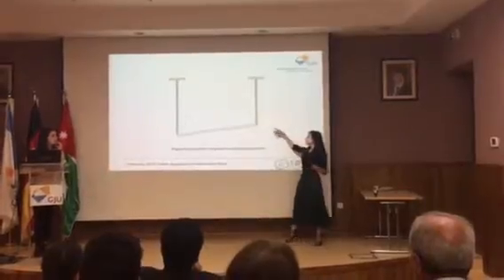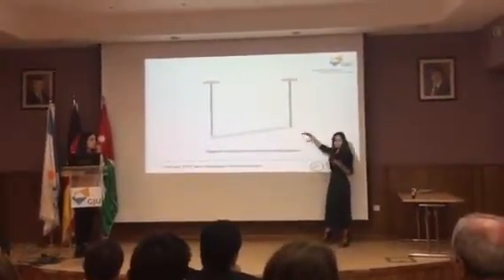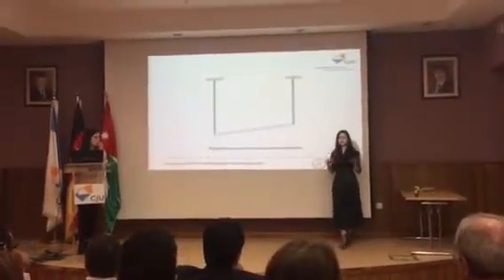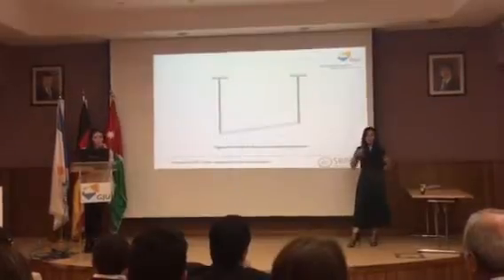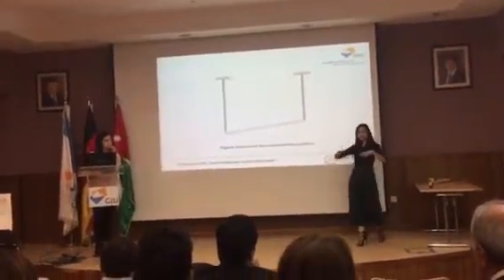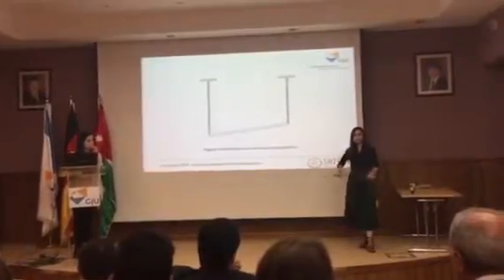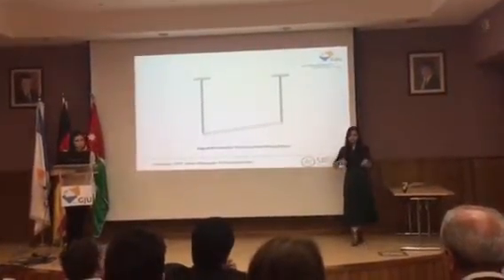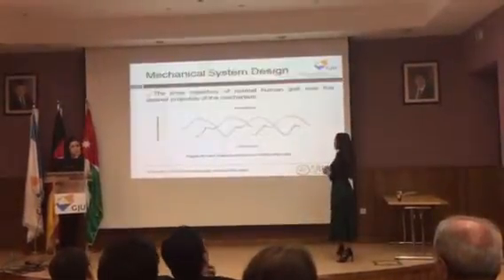where we can simply shorten the industrial chain on one side, which causes some form of inclination. That's really good when we want to correlate to the testing of prostheses on grounds that are considered uneven and grounds that have some form of inclination, especially in Jordan. We know that Jordan's grounds are not very smooth, and the terrain is pretty hilly, as Mira mentioned earlier.